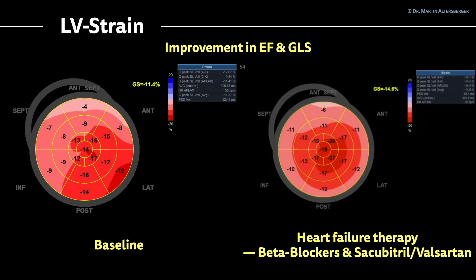To summarize: ejection fraction is mentioned in guidelines to follow up patients with heart failure, but global longitudinal strain provides important additional information. It is an early marker of reduced function, as is right ventricular strain, and it serves as a prognostic marker. In non-compaction cardiomyopathy — a very rare disease entity — this case exemplifies that imaging is key, and new modalities beyond EF such as global longitudinal strain should be used.